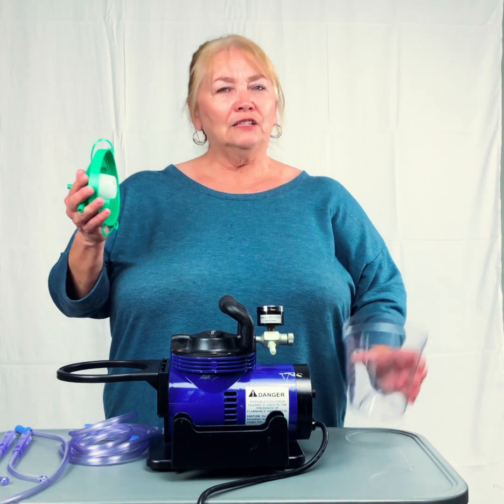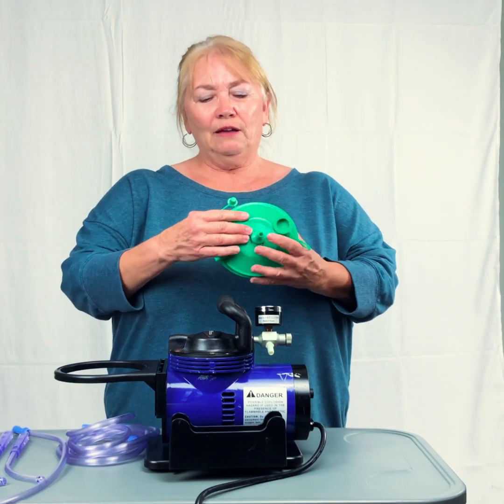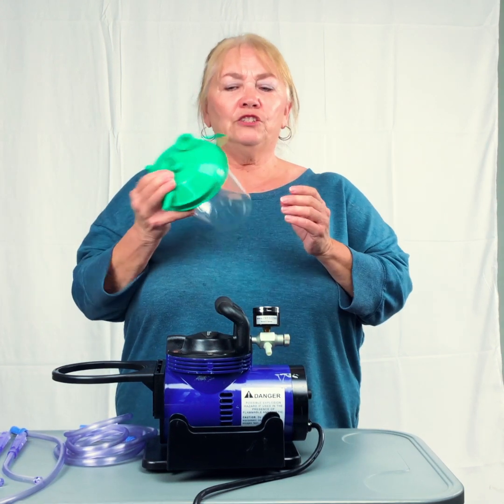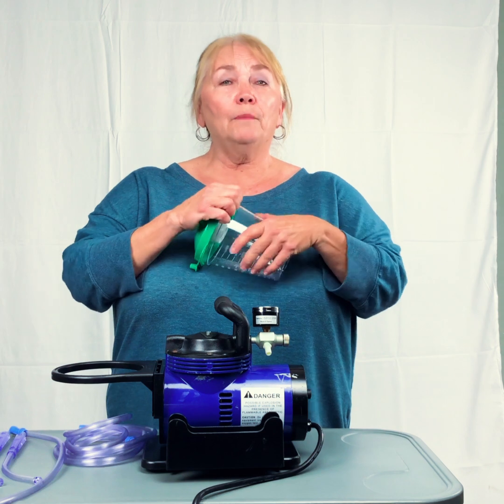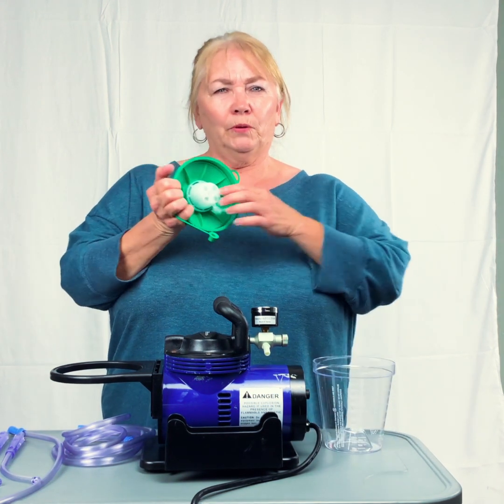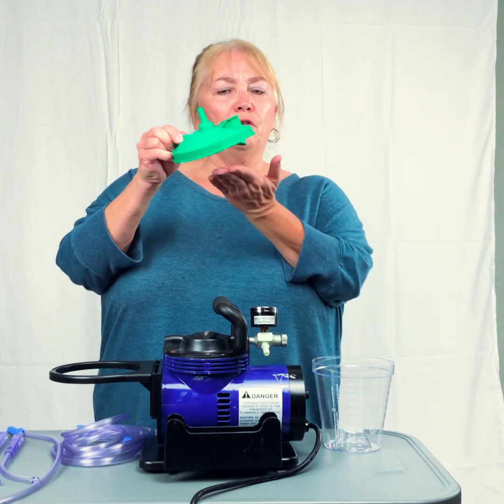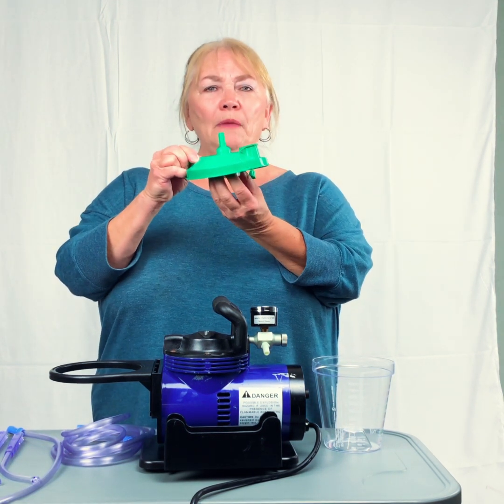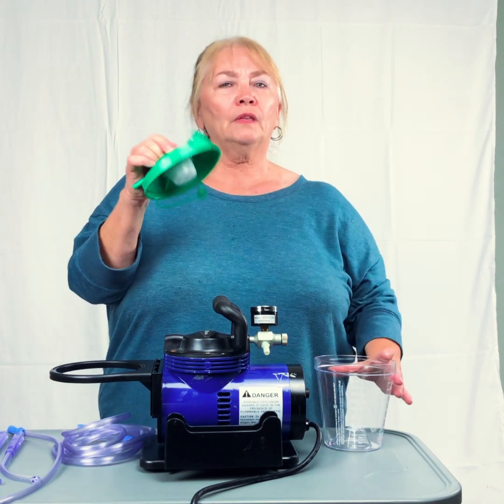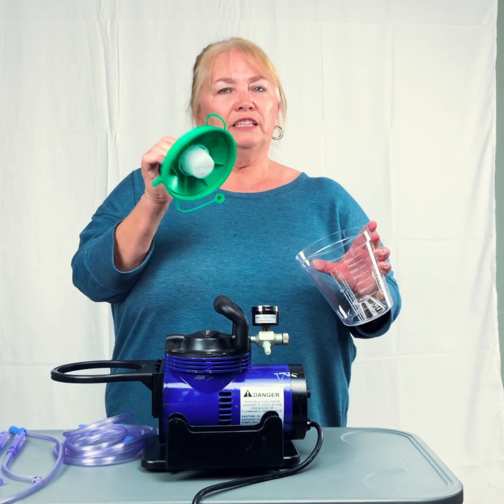First of all, as long as your canister is empty, because you don't want to do this if you have stuff in it, shake it to make sure that the float inside is not stuck from goop. Some have a plastic float, some have a foam float, some have a little rod with a sponge type thing on the end of it. Depending upon where you get them from will determine what type of lid you have.